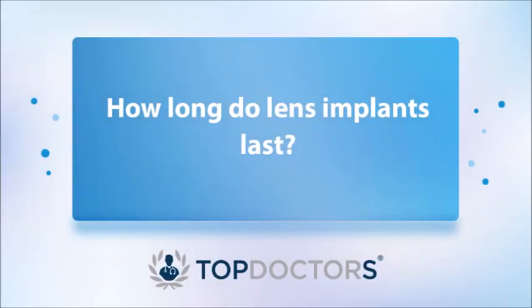Lens implants are said to last about 50 years, which is because they're made of a very inert, stable acrylic material, and that will last all of us for the rest of our lives. The chance of the lens implant moving or being unstable is incredibly small. Some of the lenses, perhaps 5 to 10%, develop a film buildup on the back of the lens because they're held in a capsular bag, and that can go cloudy sometimes within months or years of surgery, but that's very straightforwardly cleared with a laser called a YAG laser capsulotomy in the outpatient clinic.